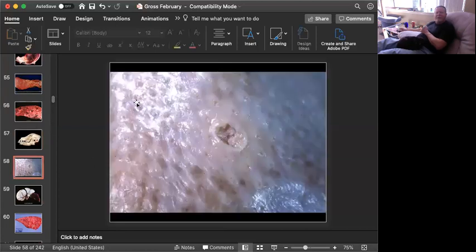Slide number 6 is tissue from a chicken. Can you give me a morphologic diagnosis or name the condition? I'm happy with either. Okay, time's up. This is an interesting condition, which is known as a keratoacanthoma. And there are a lot of people that call them dermal squamous cell carcinomas. Histologically, they tend to look a lot like that.